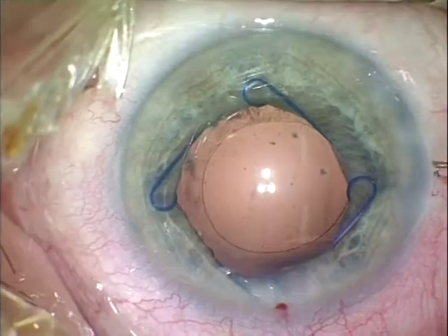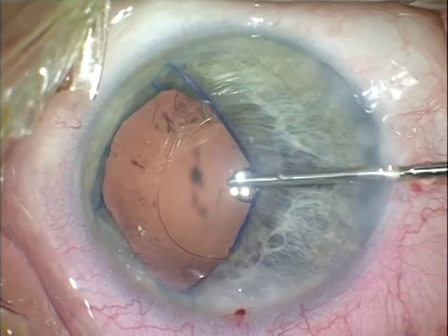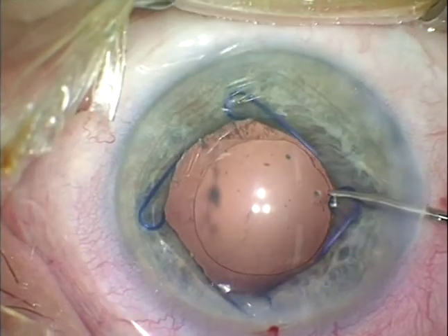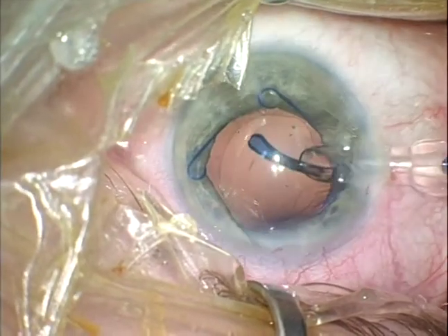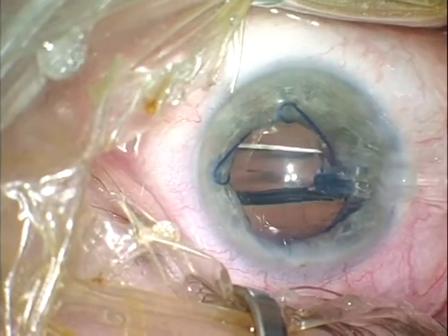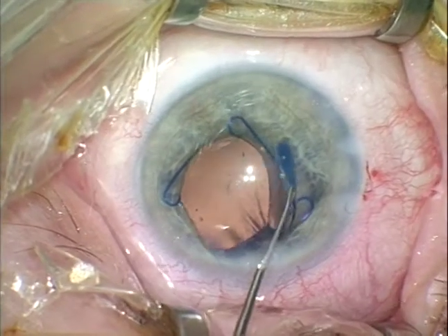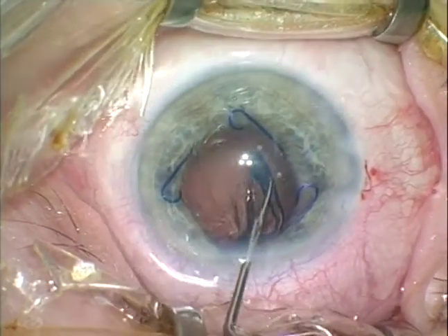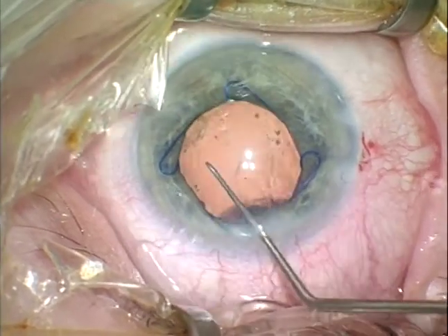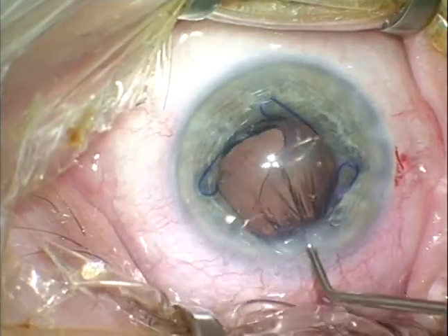Viscoelastic is injected into the capsular bag, and then we realized that the proximal scroll of the device was catching the capsule. It's now being released, and the IOL is implanted into the capsular bag with the help of the injector. It passes the pupil. Now I'm inserting the haptic of that IOL into the capsular bag, positioning it in the right direction.